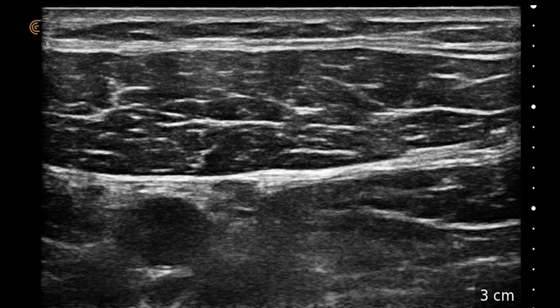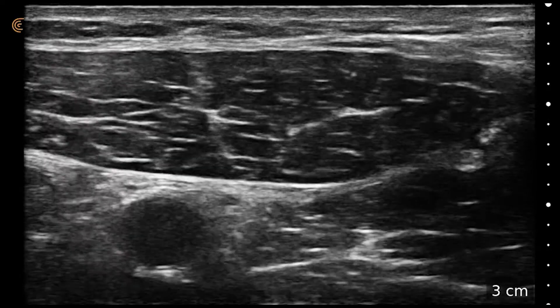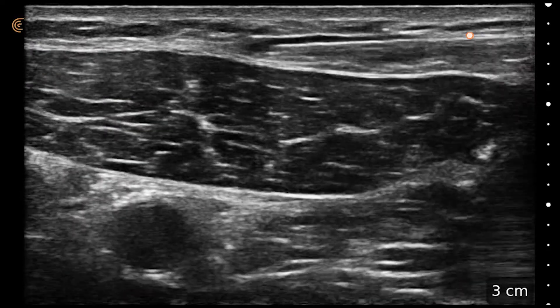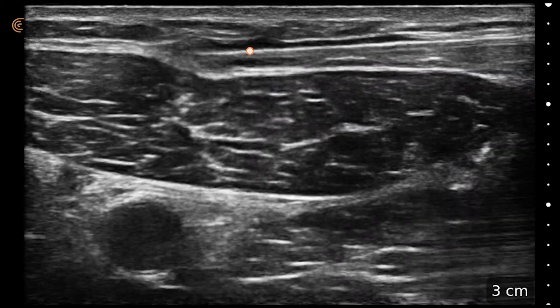So on this one, you can see what maybe looks like a nerve here, here, and here. But on this one it was really easy. I just infiltrated right across through there and just spread the local along on top of the sartorius.